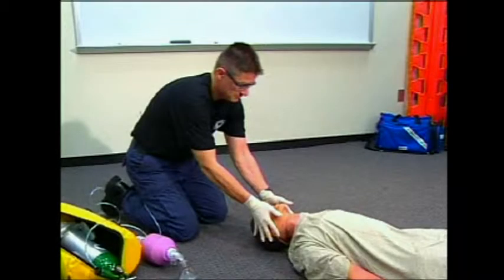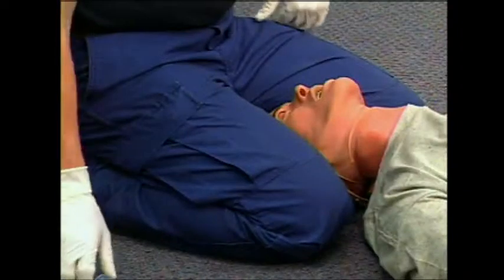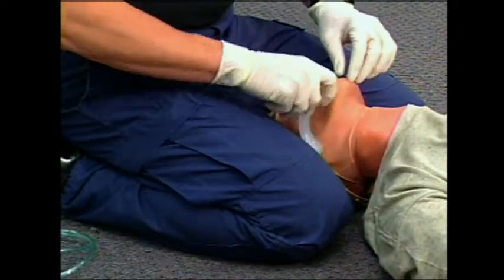This video demonstrates the proper use of a BVM with an OPA. Position yourself above the patient's head, with one knee on each side of the patient's head with slight inward pressure.